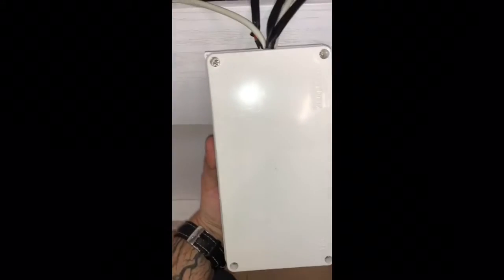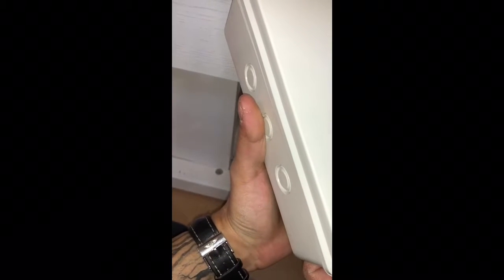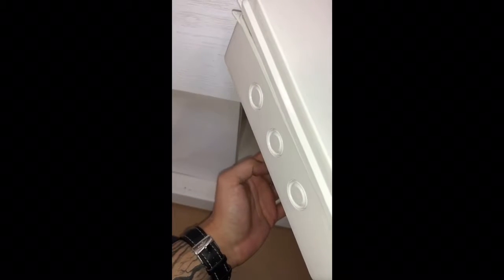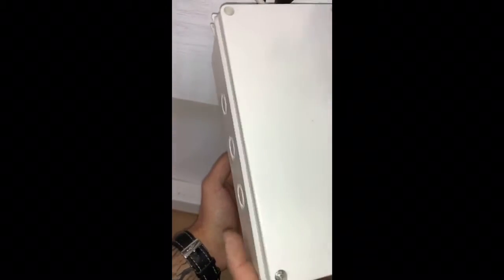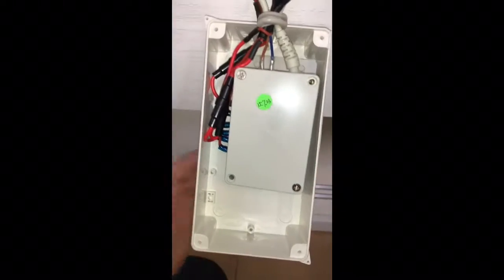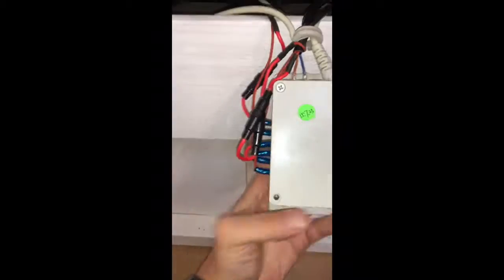Alright, so once that box is taken out, inside of that box, there's gonna be the module. So we're gonna go ahead and remove those screws. Alright, once the screws are open, you're gonna go ahead and take off the cover, and this is the module box. This is what we're looking for.